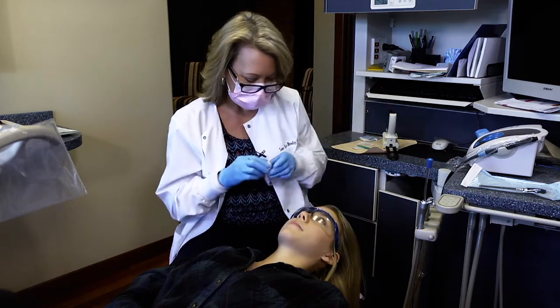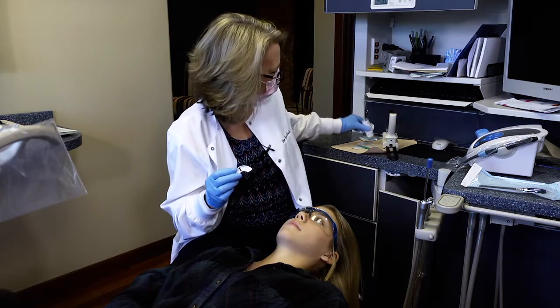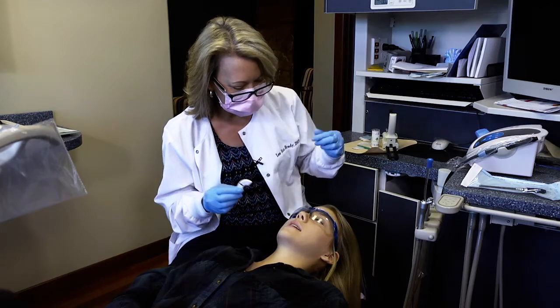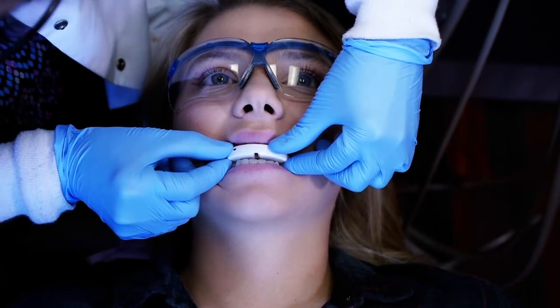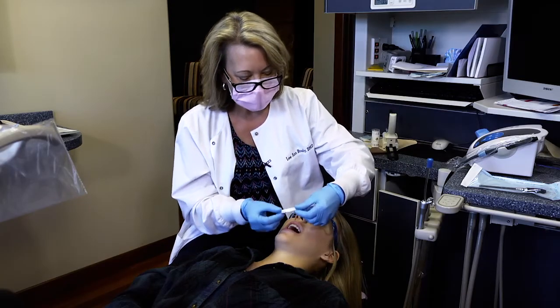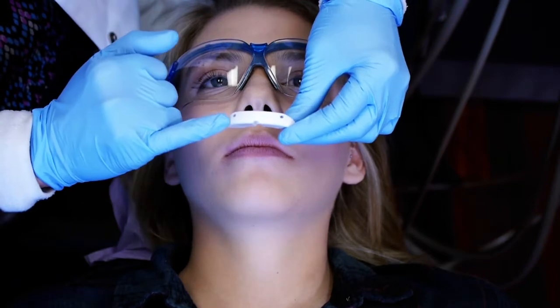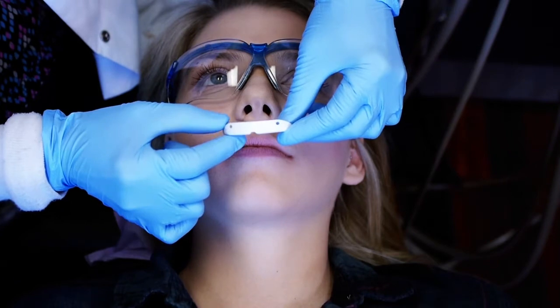The very first thing I'm going to do is get the little device. They come to us prefabricated, and I'm going to position it over your teeth and have you bite your teeth together so I can see how it works. Go ahead and bite for me. The quick splint is just a little prefabricated shell. It has two little holes in it that help with retention of the material we're going to use to custom fit it.